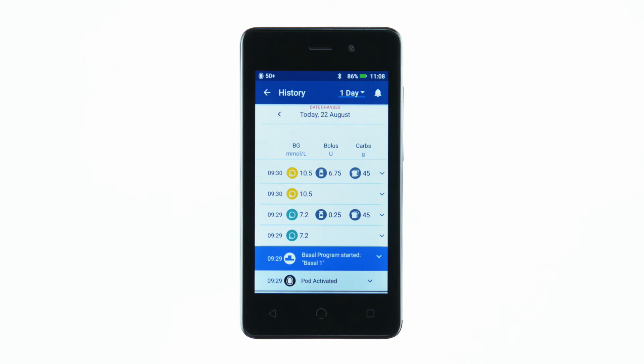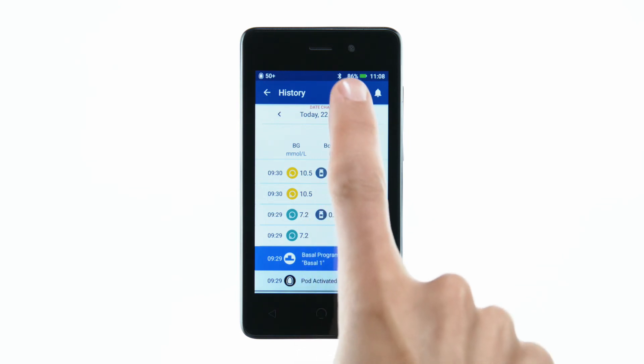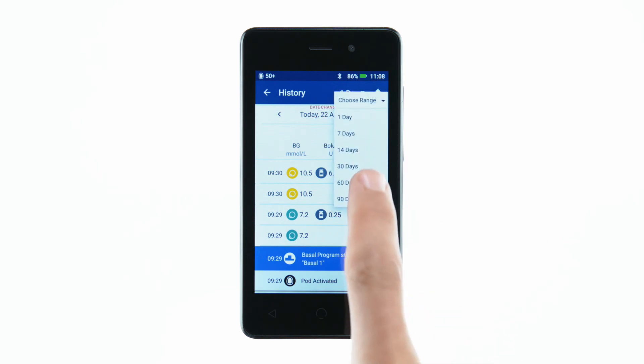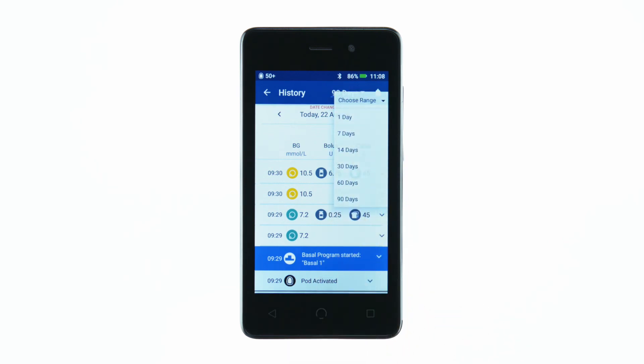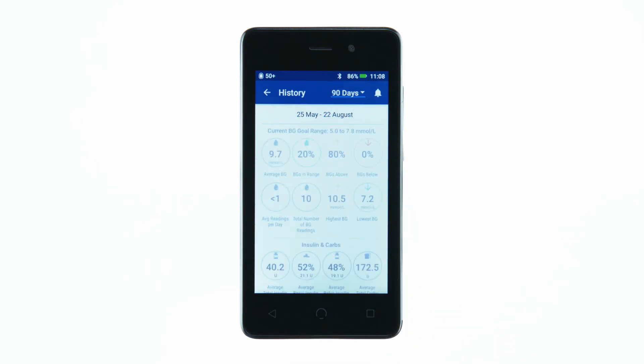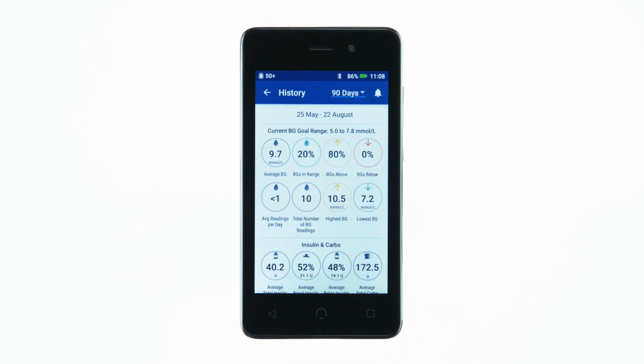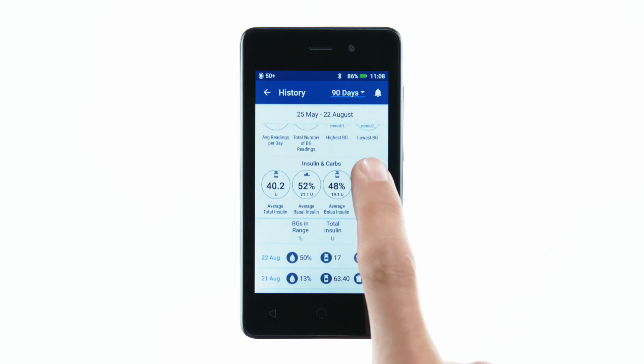To change the time span of the data you're looking at, tap the drop-down menu in the upper right hand corner. To see more details from the current history screen, swipe up.